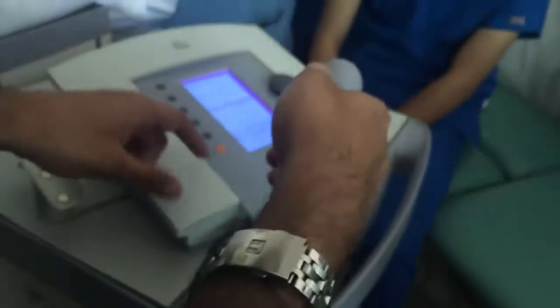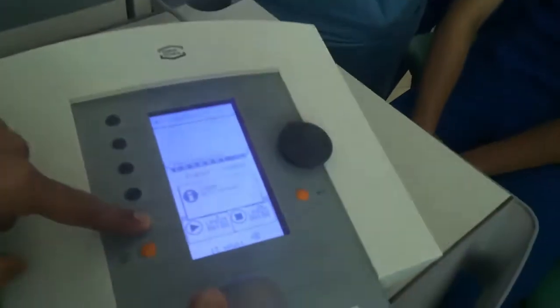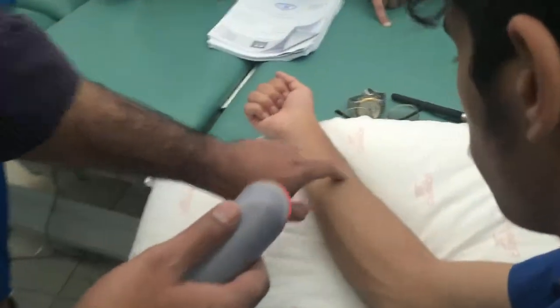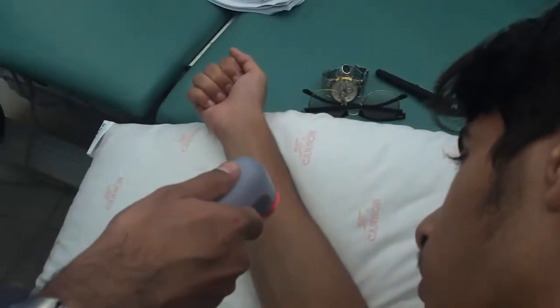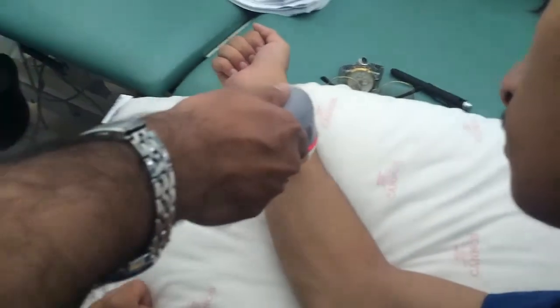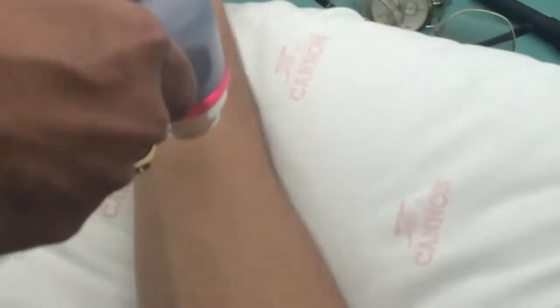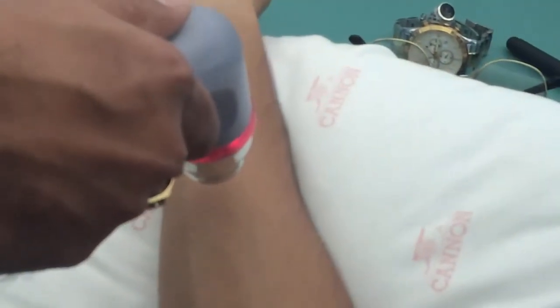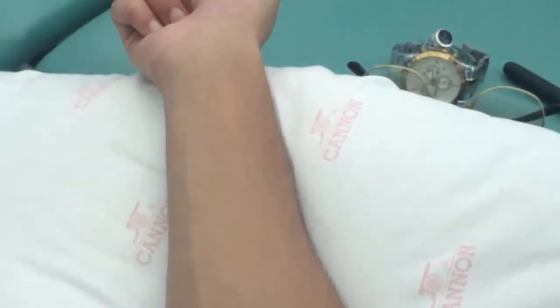Okay. So if you want to turn on this laser machine, we have to put here laser activated. So he is having a wound here. Now I am using the scanning technique. Scanning technique means we just keep moving the laser 5 to 10 millimeters away from the skin. Understood what I am talking? So like this, 1 minute and 16 seconds, I will be treating. We should not touch because we are treating an open wound.